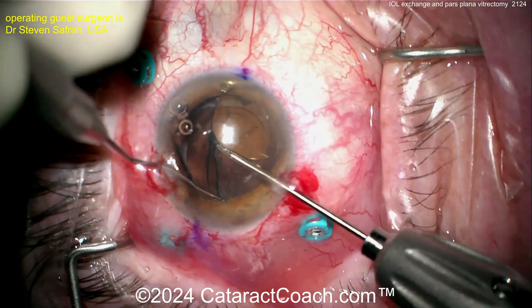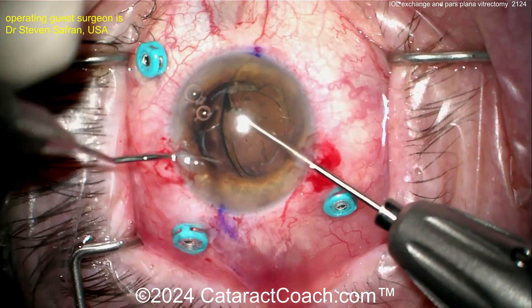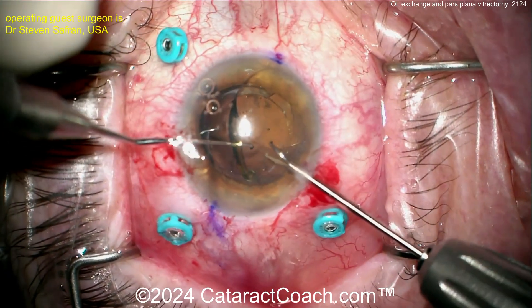Two-handed technique here with the micro forceps in one hand, and in the other hand carefully dissecting that haptic out of the bag. Look at that — beautifully done, you saw it give away.